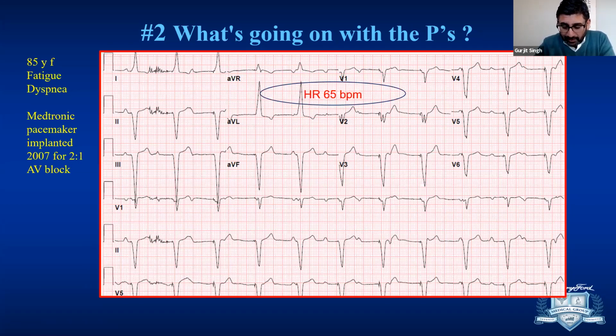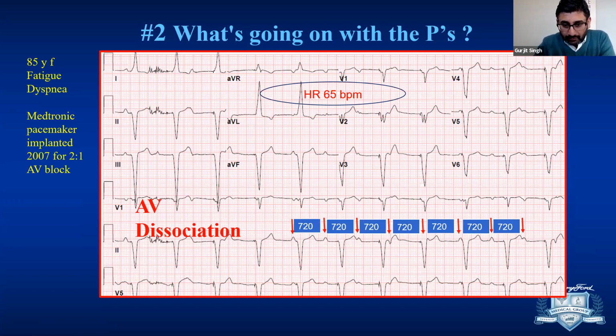So a Medtronic pacemaker, you cannot program a Medtronic pacemaker to 65 beats a minute, because that number is designed to show that the pacemaker has reached ERI, okay? So the moment you see 65 paced ventricular complexes, it's a Medtronic pacemaker at end of life or ERI. So this patient is in AV dissociation because at the end of life, the device goes to a VVI mode. It stops storing signals, it stops responding to the atrial channel as well, okay?